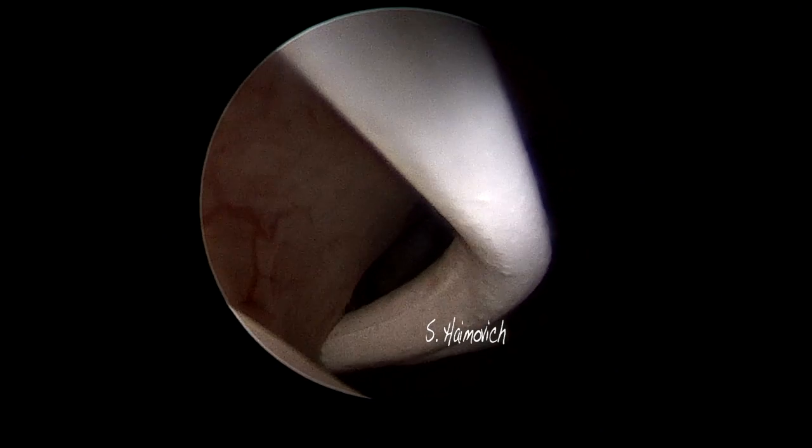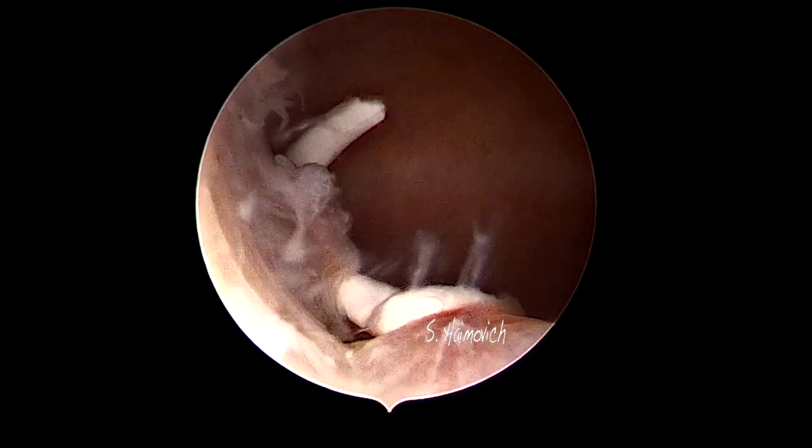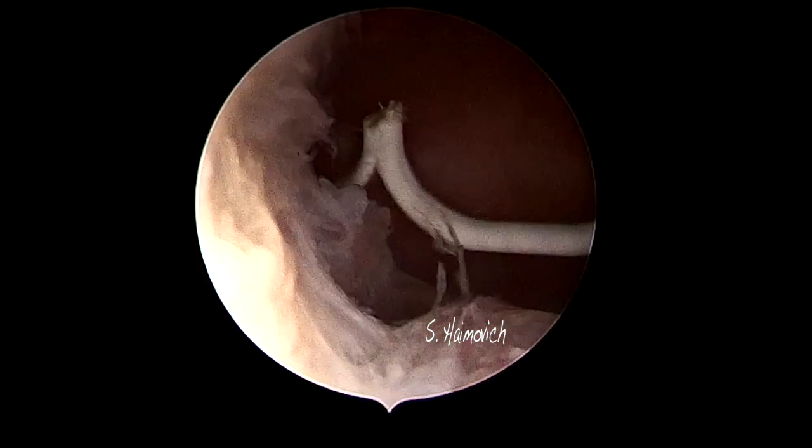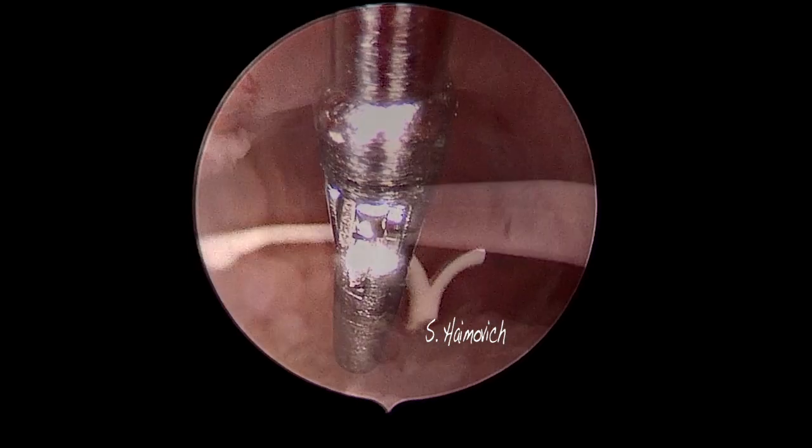Office hysteroscopy without anesthesia is the best approach compared to any other blind alternatives, even ultrasound guided. Notice the fragmented T-shaped IUD inside the uterine cavity. With a grasper we can catch and extract the fragment.